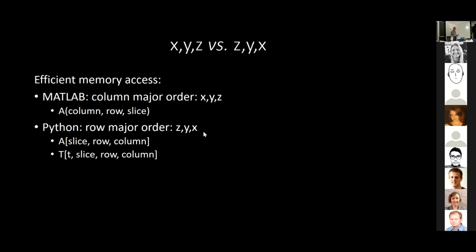But when you have the images, like a matrix, it's more like you have rows and columns in the images. And I think that is how you should think of these images, because these images might be rotated relative to the scanner coordinate system. So what is row? Is it actually the X direction, or is it the Z direction, or is it some rotated direction? It is something you might have to think about.